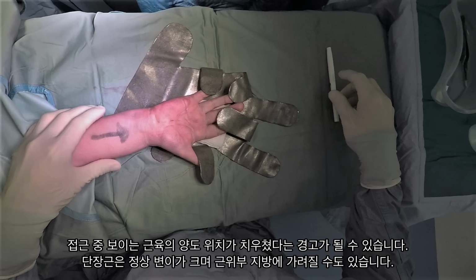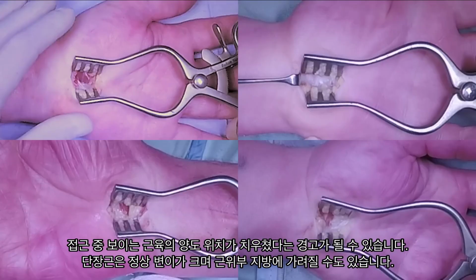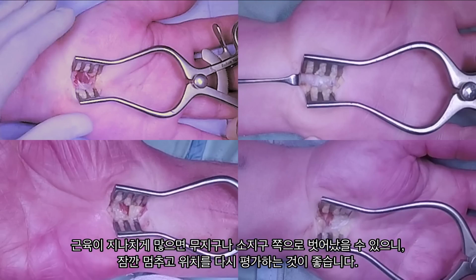Following on from this, the amount of muscle that you come across during your approach can be a warning sign of drifting too ulnar or radial. These pictures all show different amounts of normal palmaris brevis encountered after dividing the fascia. Top left is obviously the bulkiest, and top right has no muscle at all. Sometimes the muscle can be obscured by fat proximally, as we can see in the bottom left image. If you do come across a lot of muscle tissue, you may have drifted into the thenar or hypothenar muscles, being too radial or too ulnar in your positioning. It can be normal, such as the picture in the top left, but it's worth just taking a second to reassess your position.